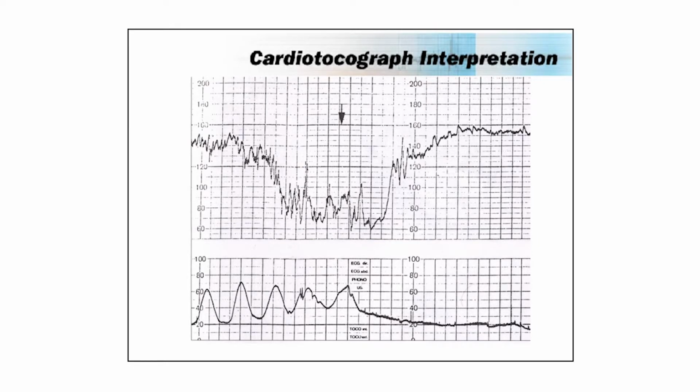So in this particular case, they gave terbutaline intravenously to counteract the effects of the oxytocin and cease uterine activity. It's a measure that's recommended in many guidelines that if you have a severely abnormal fetal heart rate pattern secondary to uterine hyperstimulation caused by oxytocin, administer terbutaline intravenously. And it stops the contractions immediately, as you can see.